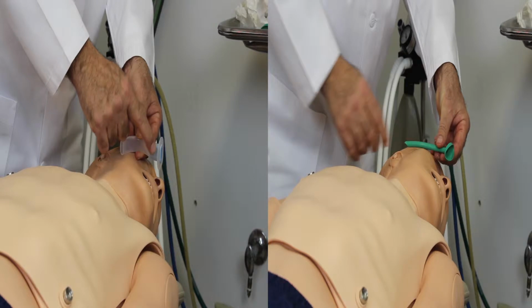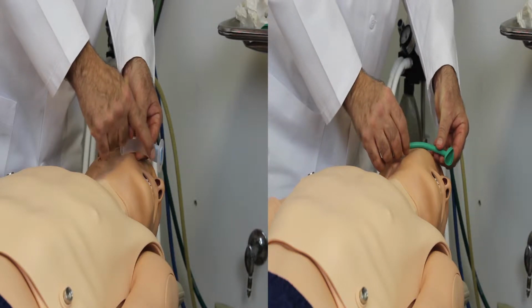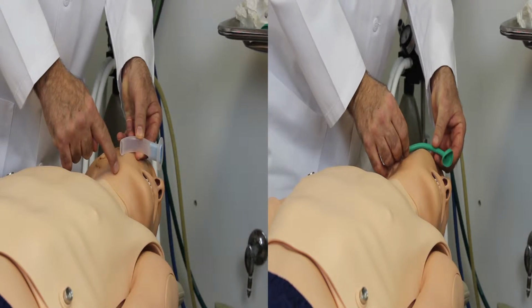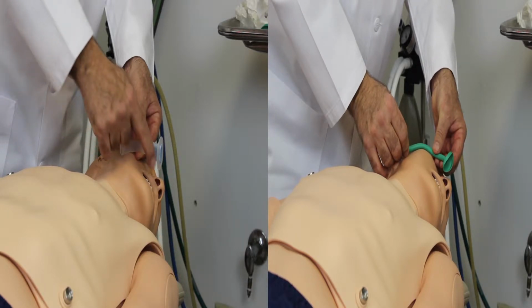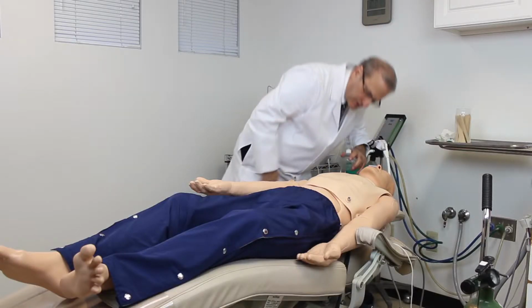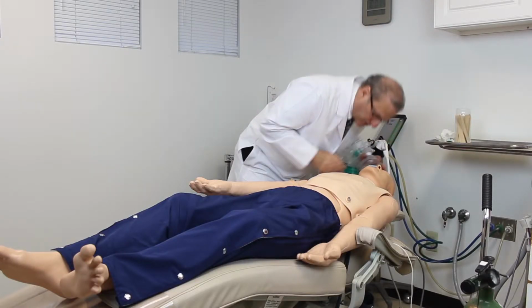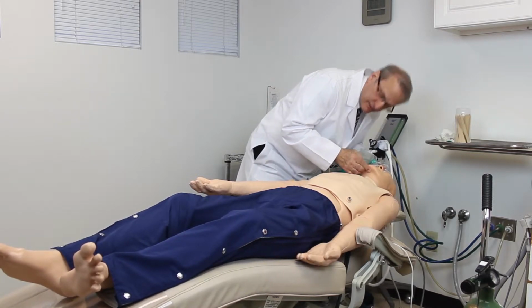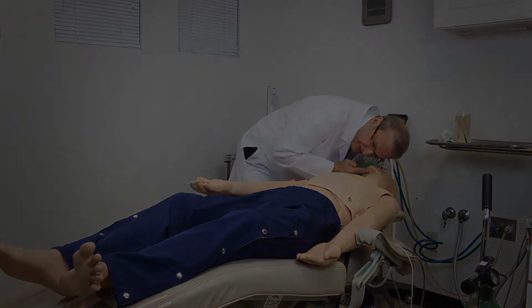These devices help us to get around a swollen tongue or a tongue that is just difficult to get off the pharynx when we do the head tilt, chin lift, or jaw thrust maneuver. Again, consider calling 911 if we have any trouble with ventilations and the patient does not respond rapidly.